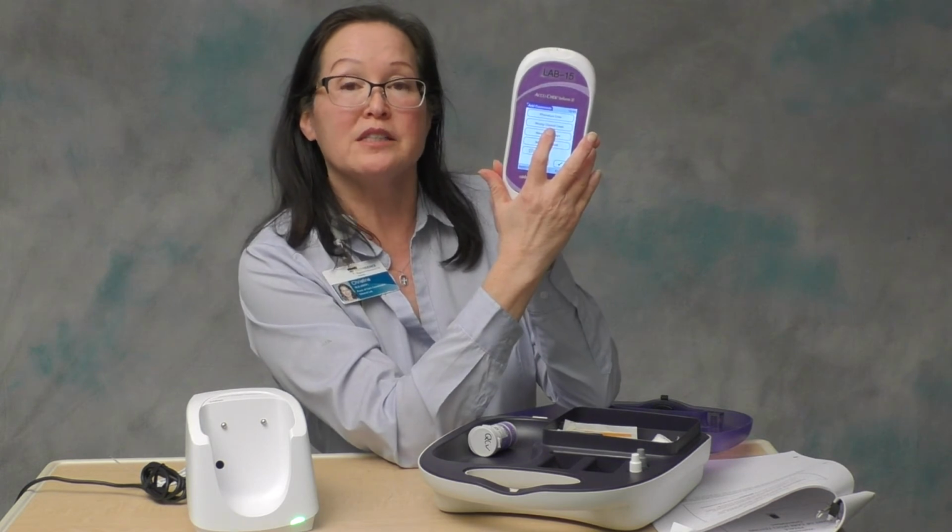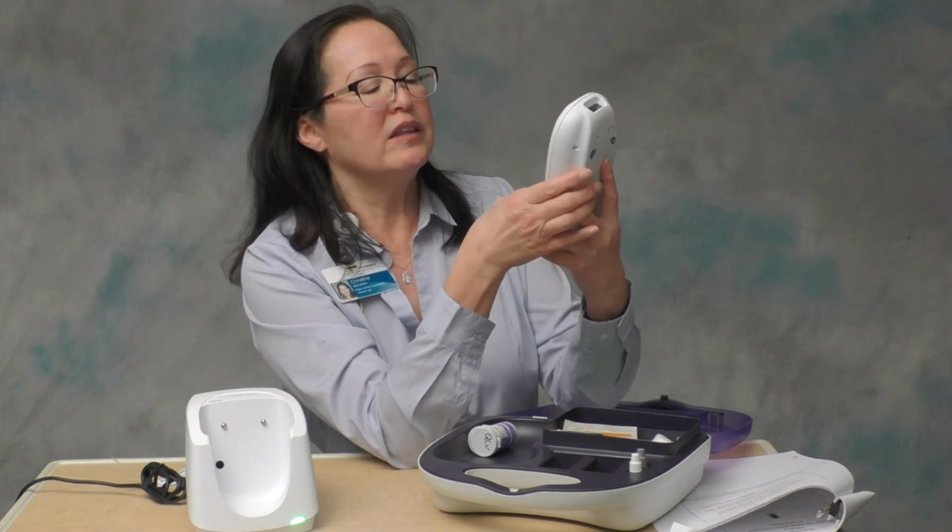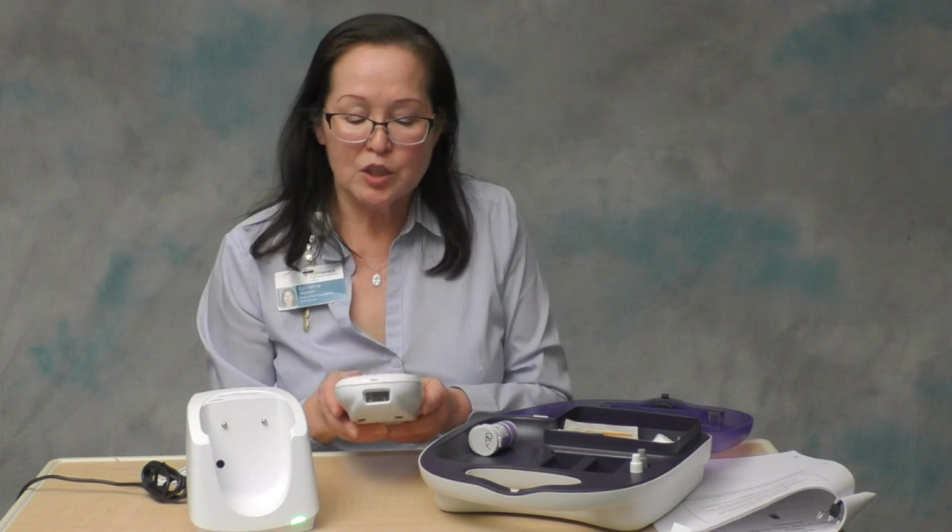So if you realize that you dosed it with the wrong bottle, just attach that wrong control used to the result, and then we'll know that you used the wrong control and you can repeat the controls. So make sure that both of your controls pass before the instrument is allowed for patient use.